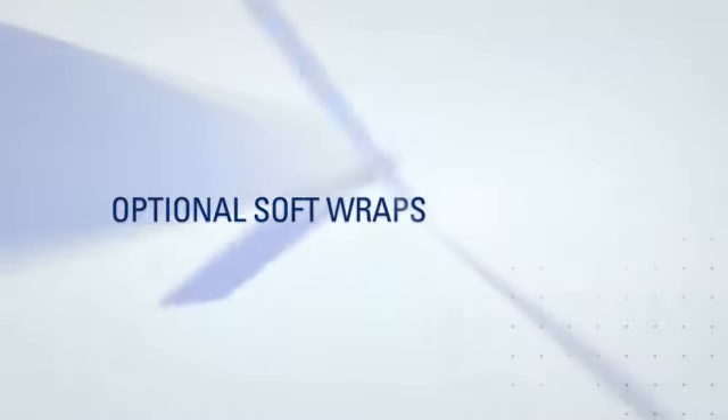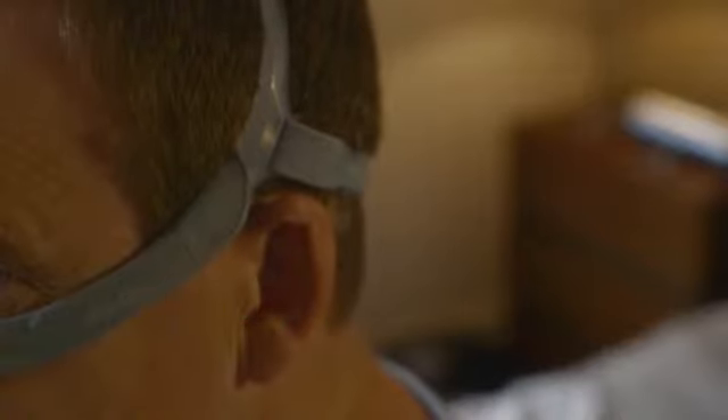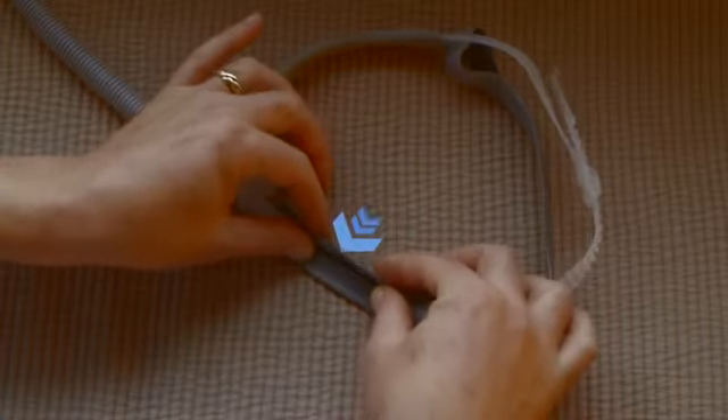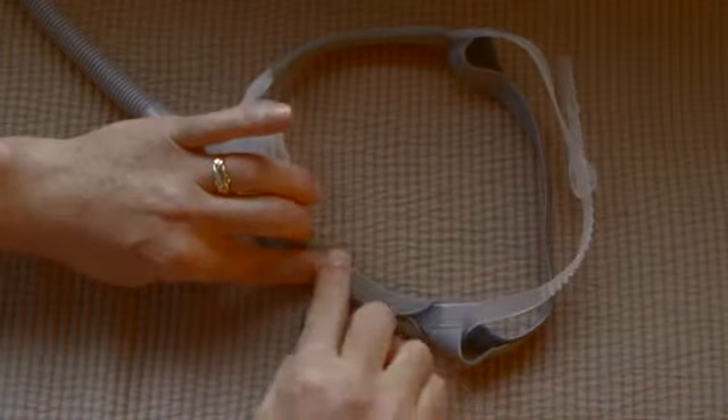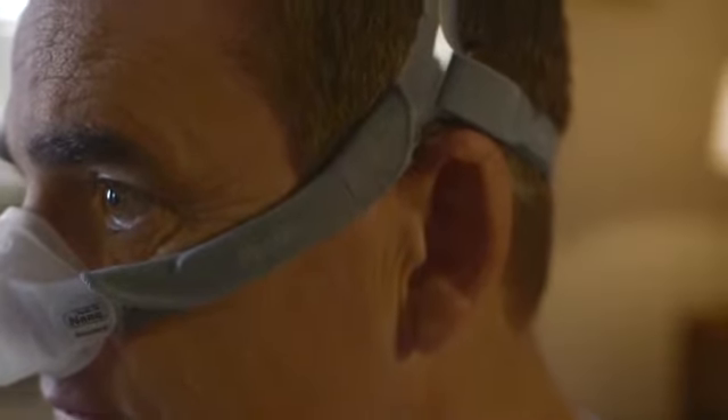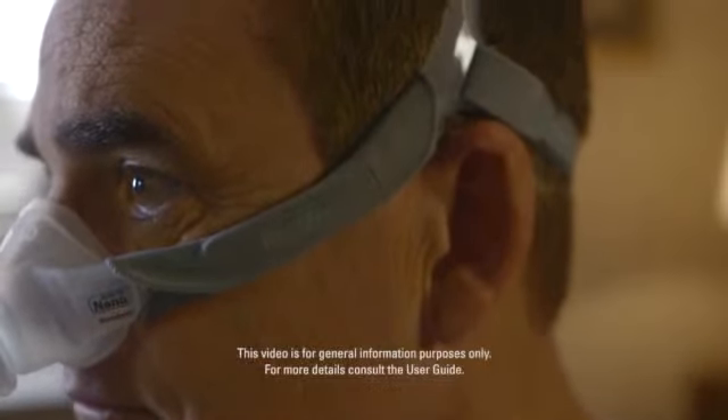The soft silicone headgear also comes with optional soft wraps for an extra cushion around the cheeks, to make using your Swift FX Nano nasal mask even more comfortable. To put them on, wrap each around either side of the headgear, folding the top fastener over the lower one. The soft wraps should be positioned on your cheeks with the fasteners on the outside.